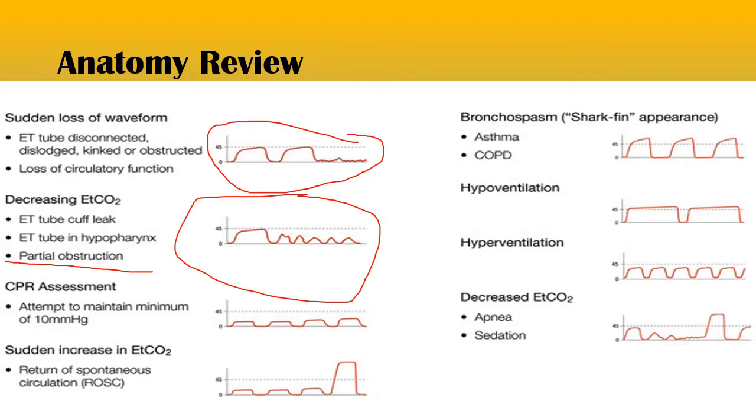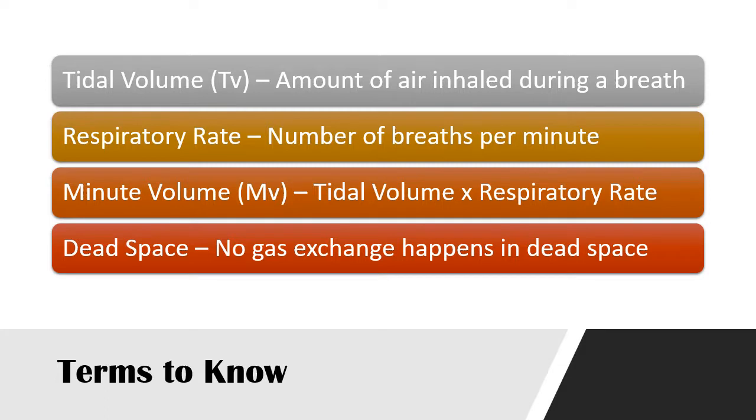If you remember before, a few modules ago, I talked about how C3IFT is changing. We know that if you look on the state website and you look on the required equipment list, end-tidal CO2 is not required but optional for transport ambulances in West Virginia. When the new protocols come out for C3IFT, if you're going to be doing C3IFT, you're going to have end-tidal CO2 capability.